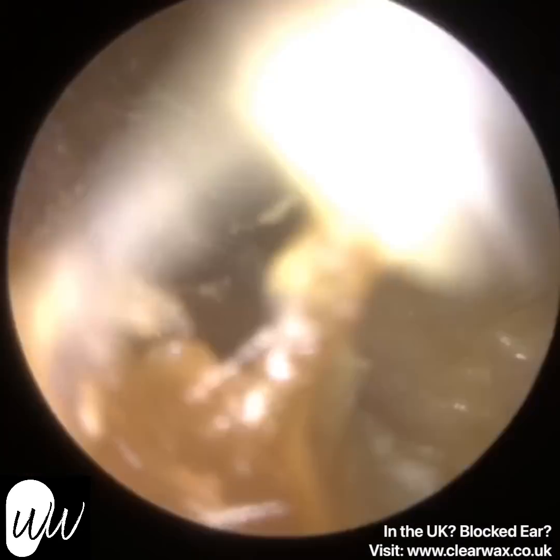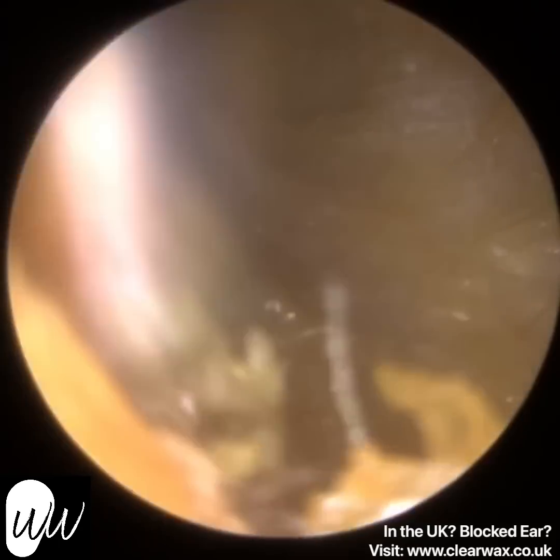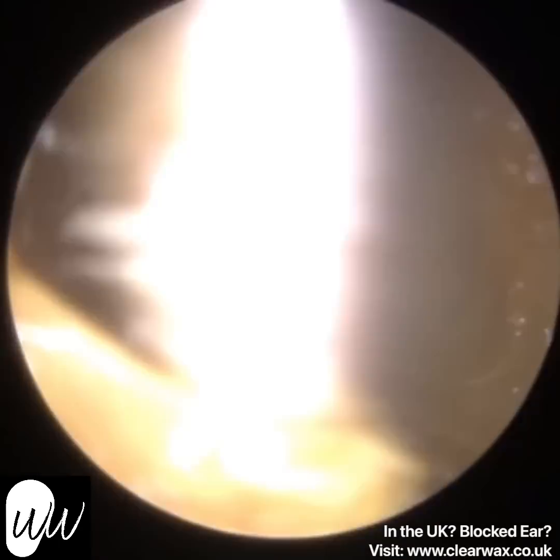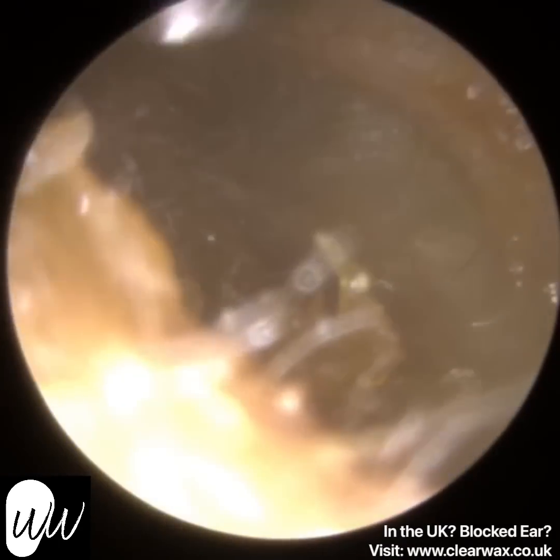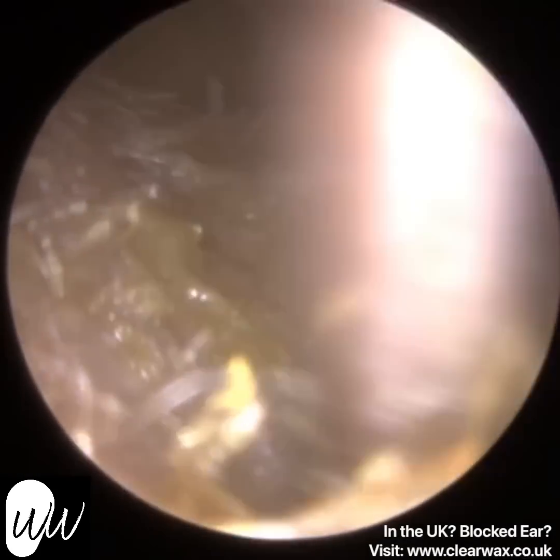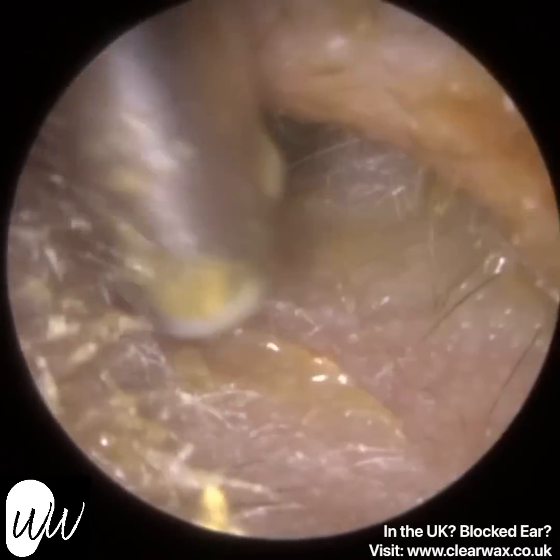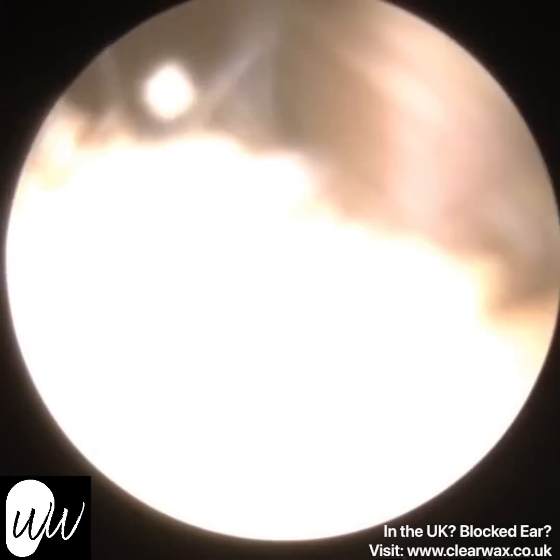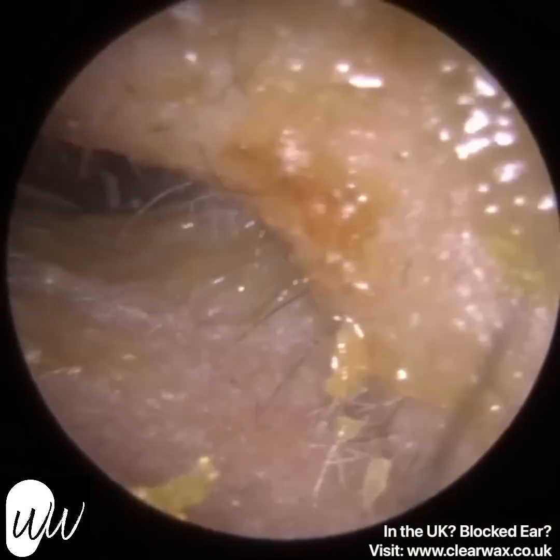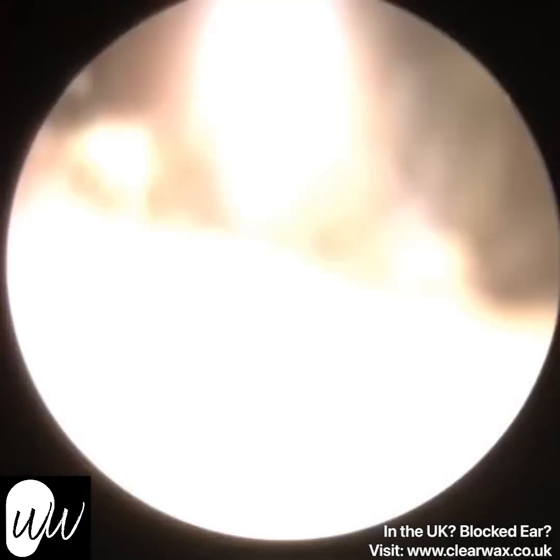So oto is Latin, I believe, for ear. Itis is a medical term given for infection. So ear infection, and then externa is the external part. But I think all this discharge is actually not due to otitis externa. It may also be a combination, but more likely all this discharge is coming from behind the eardrum in the middle ear. So we call that otitis media.